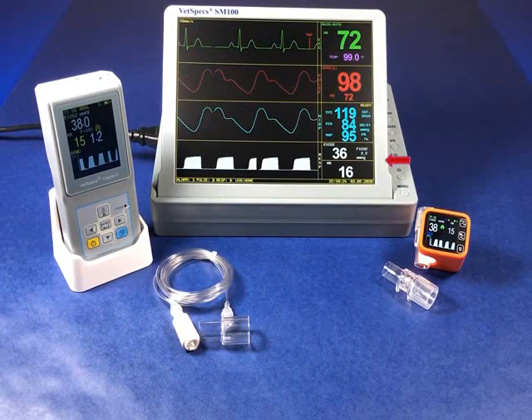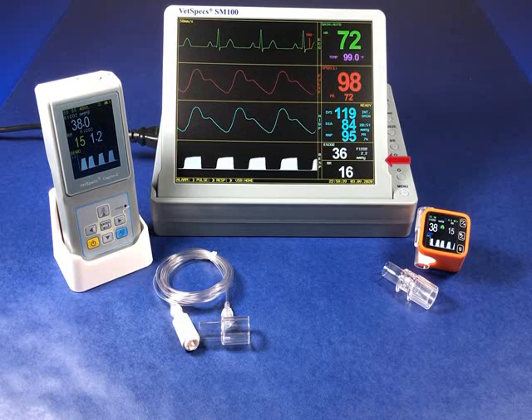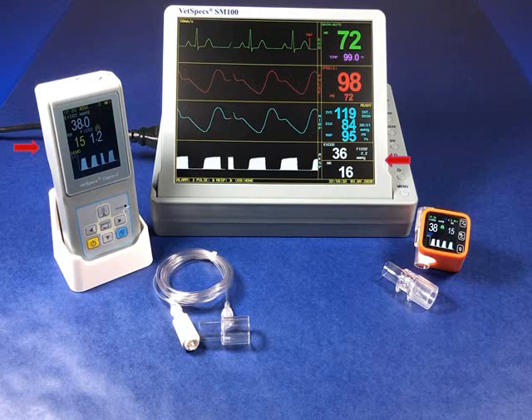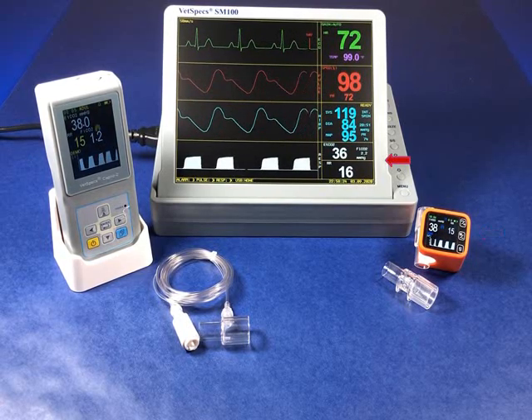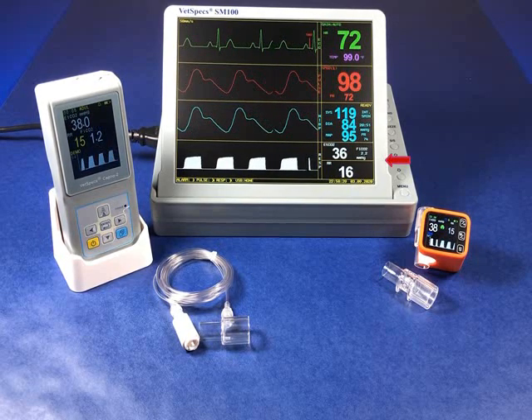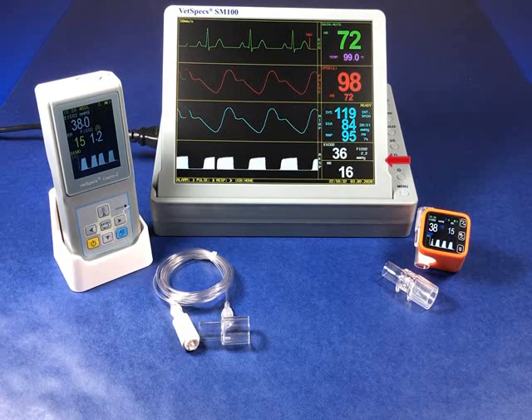With carbon dioxide monitoring being at the forefront of modern-day patient care, the SM100 is able to communicate via wireless Bluetooth transmission with our handheld CAPNO2 and our miniaturized CAPNO-M. When paired with either, the SM100 displays a CO2 waveform and the values for end-tidal CO2, fractional-inspired CO2, and respiratory rate.